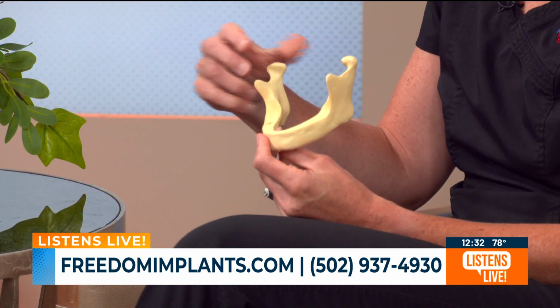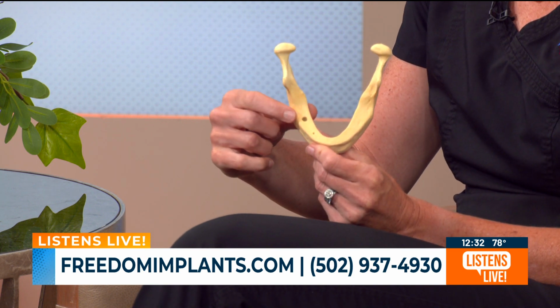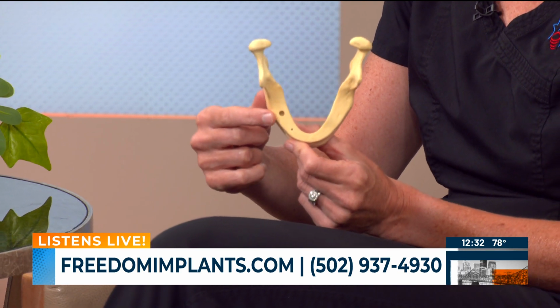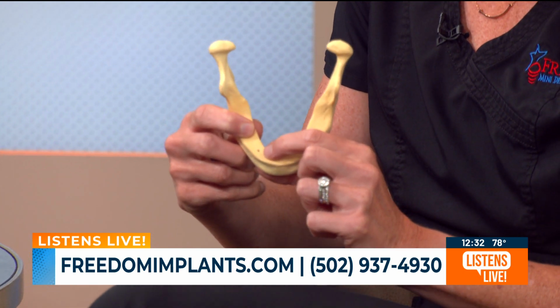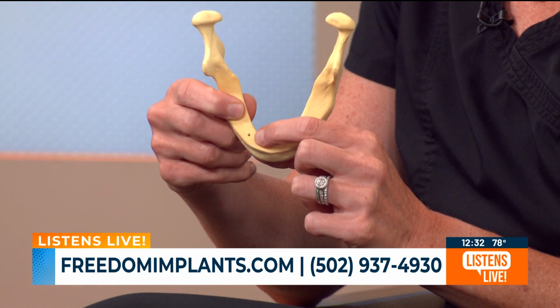As we talk about, you mentioned the models here. I think this one that's closest to me does a good job of showing what mini actually means. Yes, I think it speaks volumes for explaining the difference. So when I place a mini implant, I do not have to make this big hole. That's the more traditional one where they make an incision, place an implant. It can almost be like a year-long process back and forth sometimes. So the mini implant, I'm going to cover this hole up because it's hard to see. So there's a little small hole right here, and that is what we call a pilot hole, that I have to make to place the mini implant.